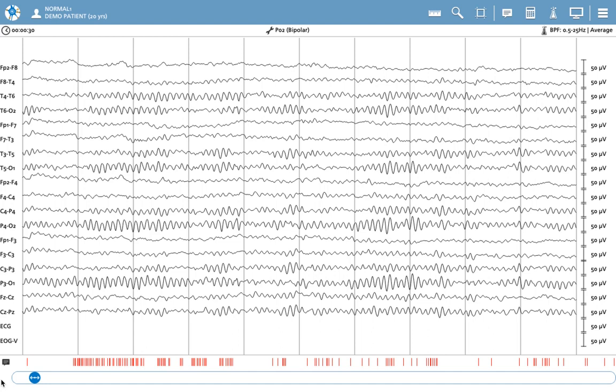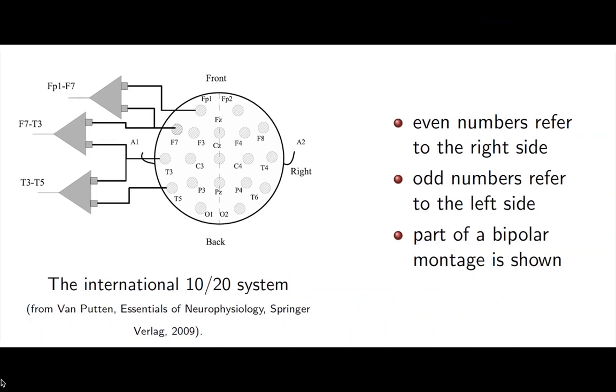First, it's good to know that as brains are spatially inhomogeneous, both regarding function but also in the generation of rhythms, we typically use a spatial sampling of brain rhythms. This means that we don't use a single recording, but we record rhythms from different parts of the brain. And that is illustrated here.